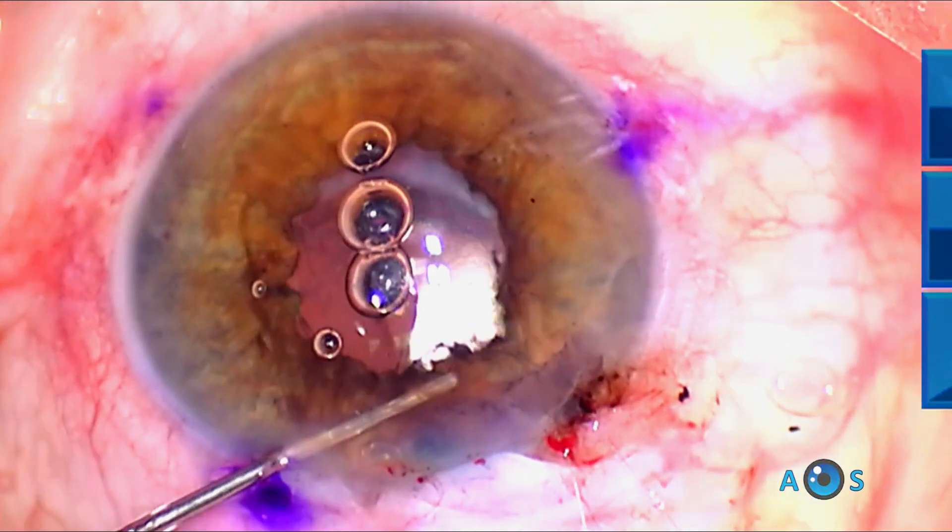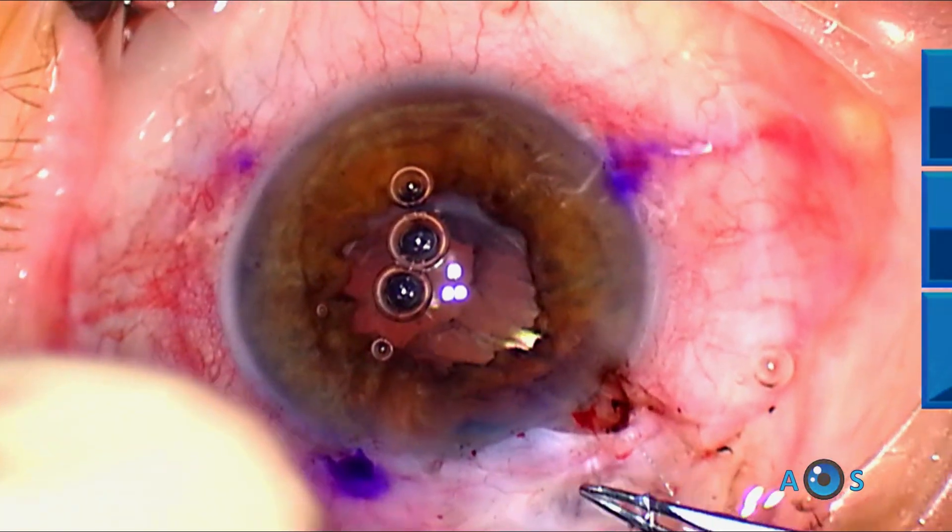The pupil is looking good — nicely round and centered. It is time to tie the suture threads.